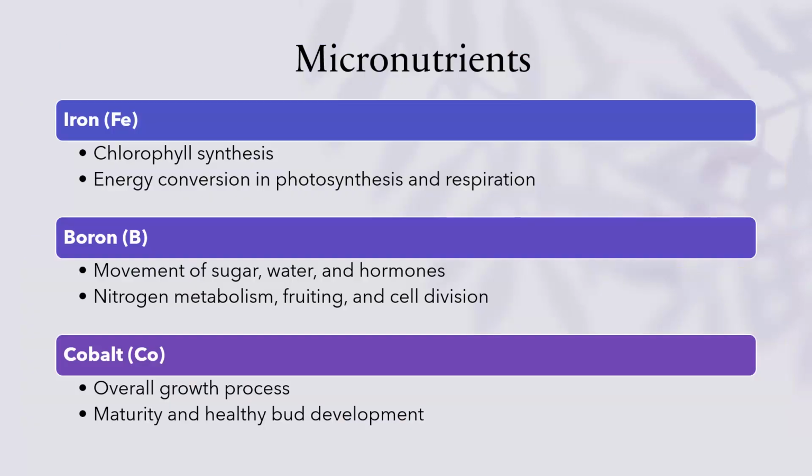In addition to the major elements that plants require, a number of other elements are essential to good growth but are needed only in extremely small quantities. They are called minor elements, trace elements, or micronutrients. Several micronutrients are toxic to plants in excess amounts. A few of the important micronutrients will be discussed here.